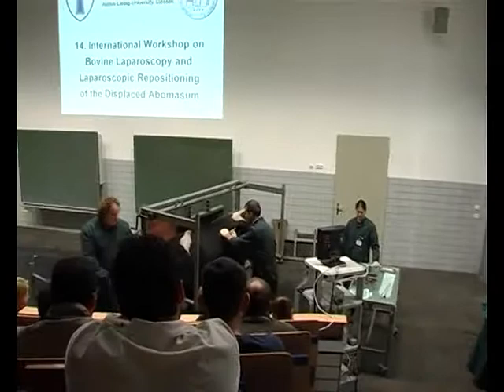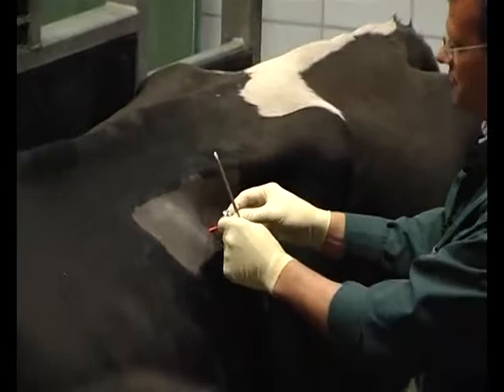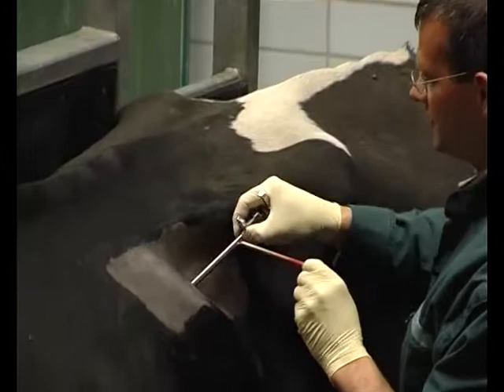We do an incision, only 1 centimeter. Take our 5 millimeter trocar with an opened tube. Insert. Remove. And here's a passive inflow of air. We remove the head of the trocar and have a pneumoperitoneum in a few seconds. If you have enough place around the trocar, we remove it and insert the 8 millimeter.